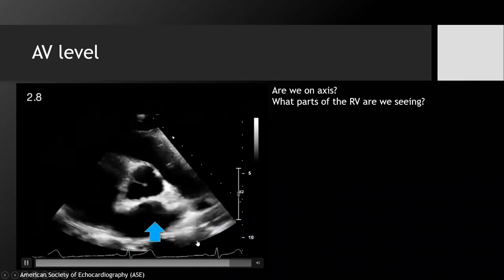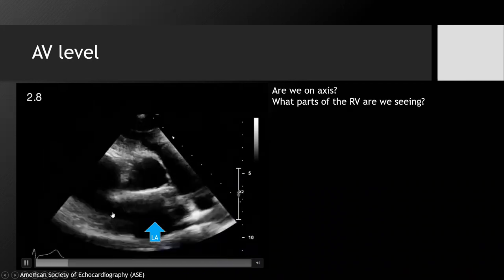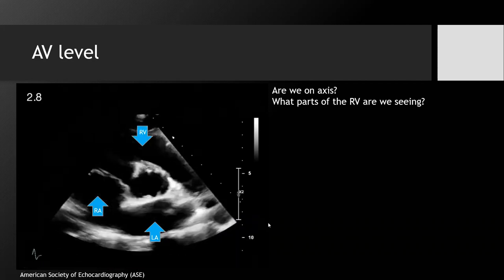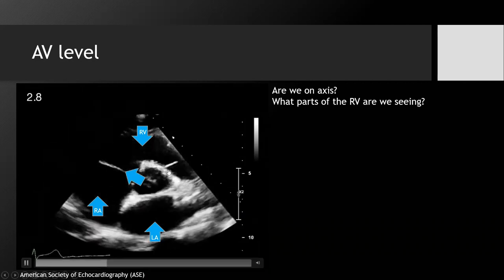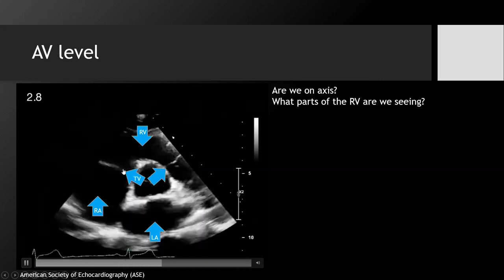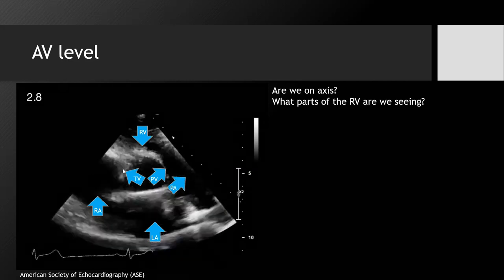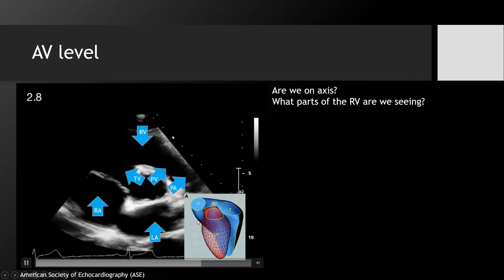Well, this right here is your left atrium. Right here, you have your interatrial septum. It's very, very thin, so at points it looks like there's nothing there. Then you have your right atrium, and this right here is your right ventricle, which would make this little flopping leaflet thing here your tricuspid valve, and this your pulmonic valve. You can actually, on a good day, go a little bit further and see, well, after the pulmonic valve is your pulmonary artery.